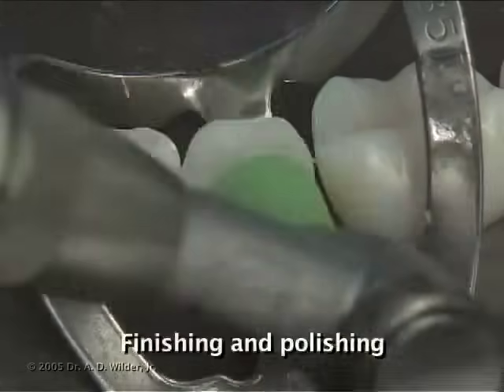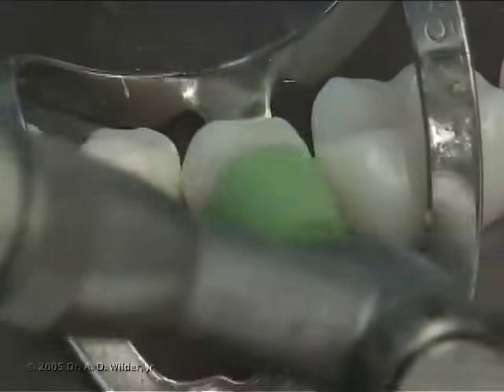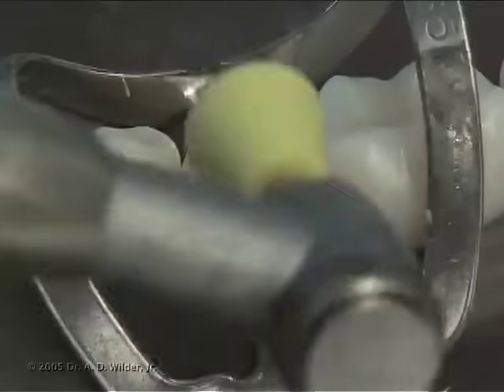Finally, you can finish and polish the restoration with a silicone impregnated rubber polishing cup. Green, then yellow, and then white is the typical coarse-to-fine Jiffy polishing system.